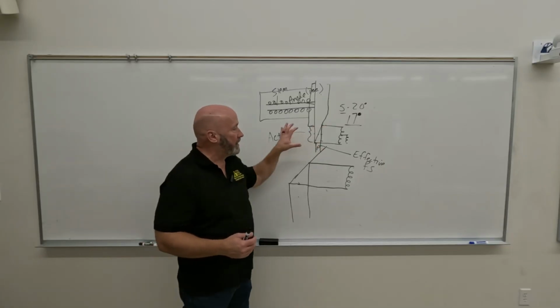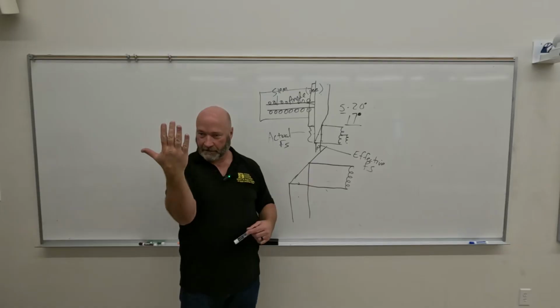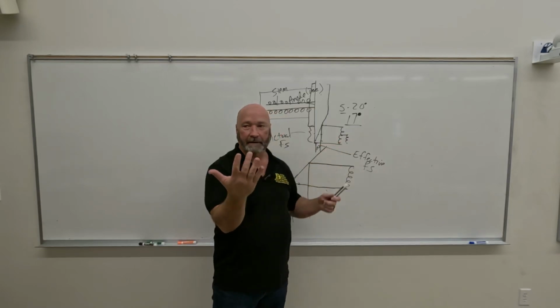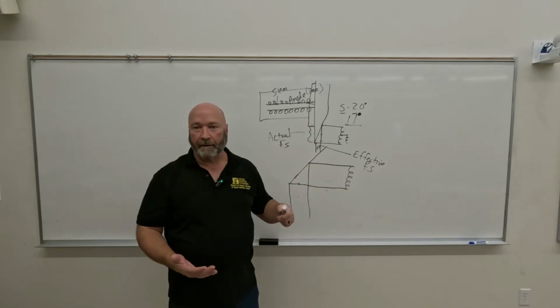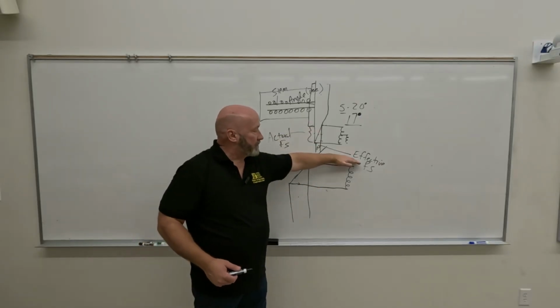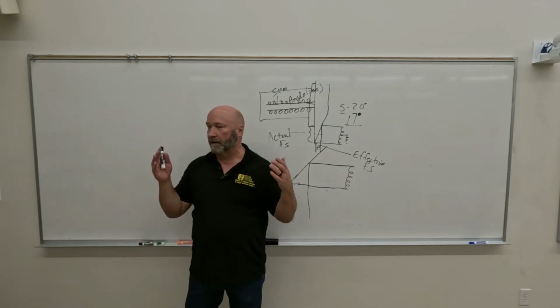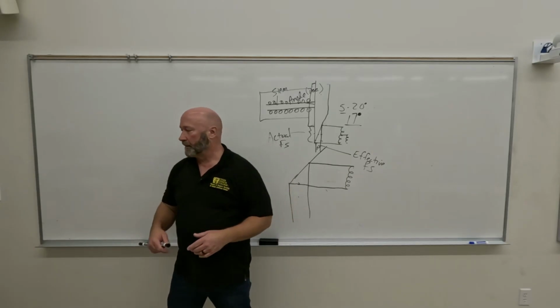if you were looking straight onto the anode, you could see the actual area of bombardment, right? You're just looking straight onto the anode. Your eyes are replacing the cathode in the X-ray tube. You're staring straight down onto it. You can see the area of bombardment. It's quite large. But the projected focal spot, which is what we refer to as the effective focal spot, would be as if the patient was laying flat on their back and they're looking up into the X-ray tube.